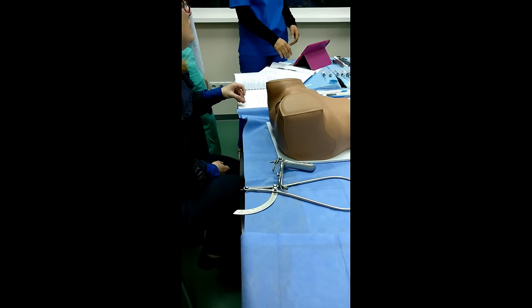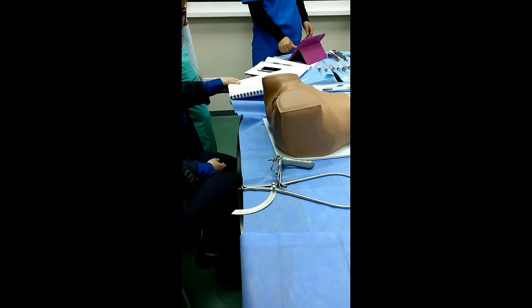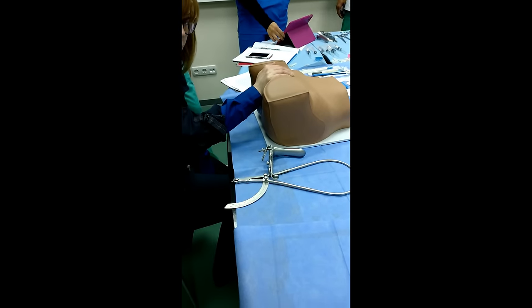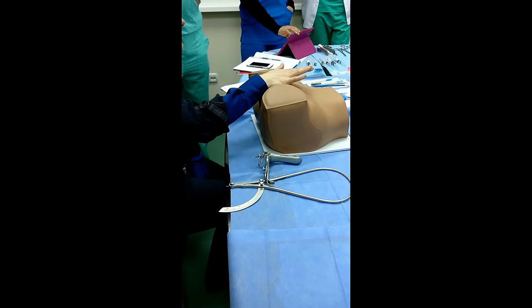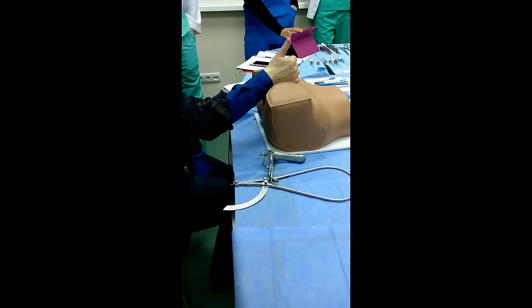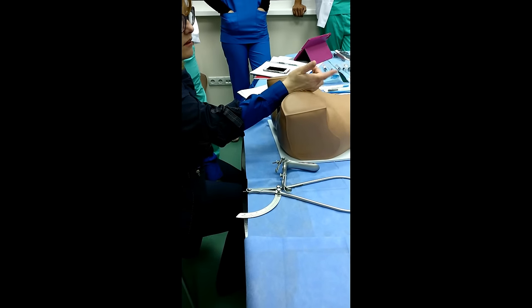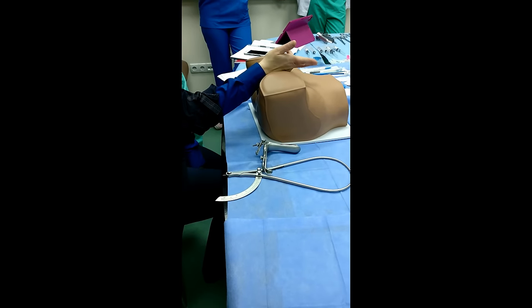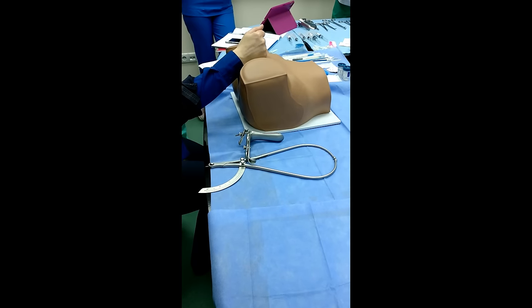Now, the manual vaginal exam. It is performed always after speculum examination. You must know that it's always after, because during the speculum exam you see the appearance of the cervix, and second, you collect material for bacterioscopical or cytological exam. We cannot perform vaginal digital examination and after that collect the material.